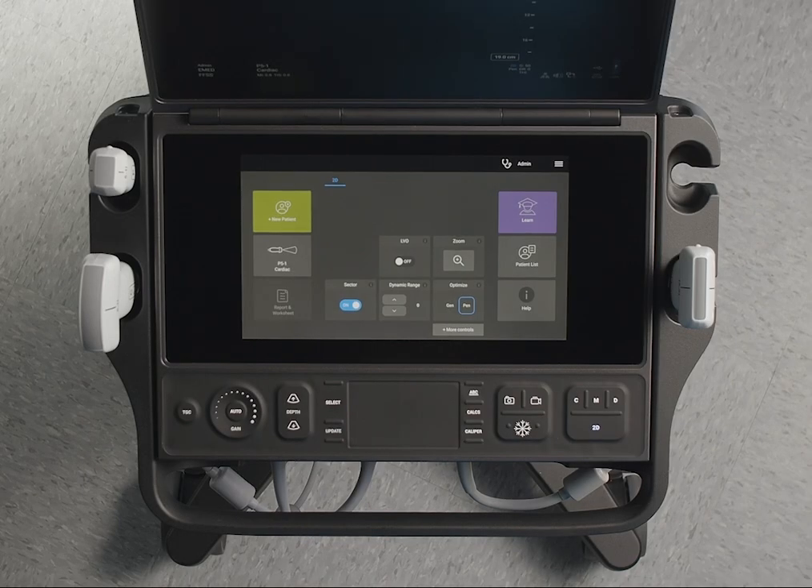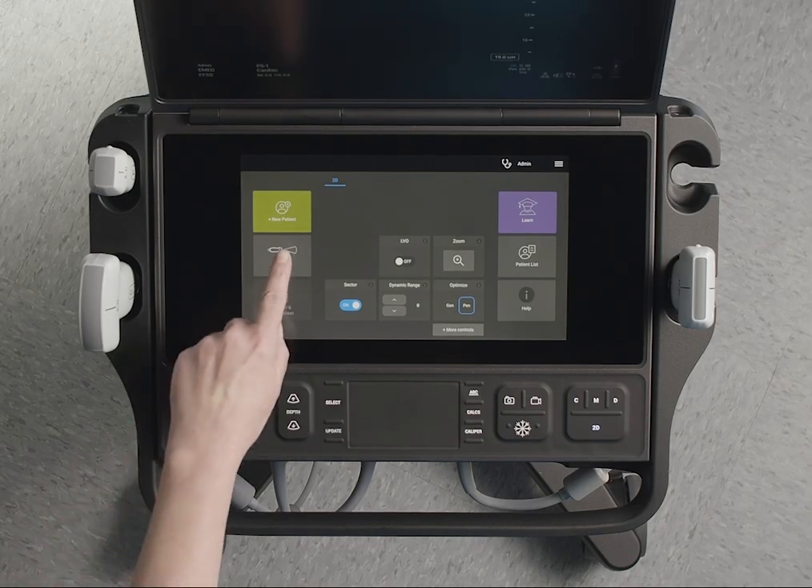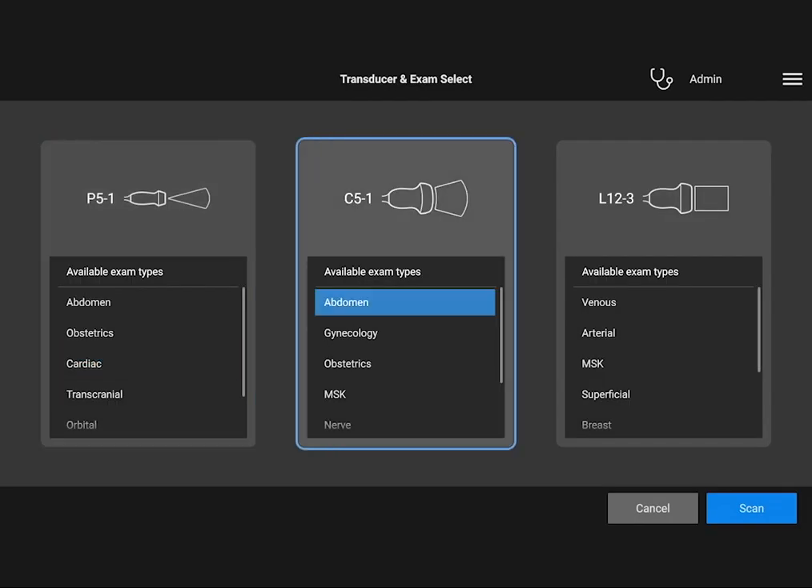To change an exam or transducer, tap the Transducer Exam button to go to the Transducer Exam Select screen. There, you can choose an available transducer and exam type.